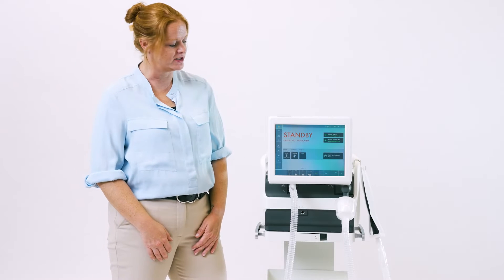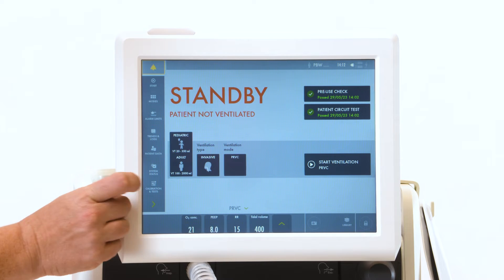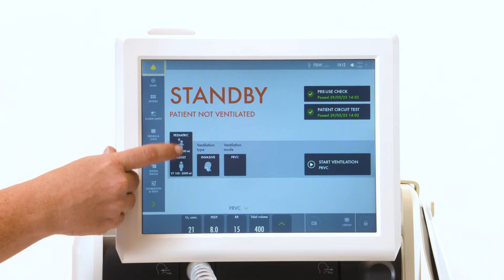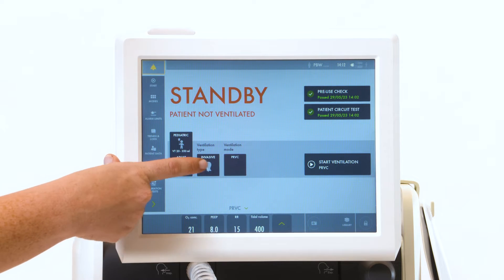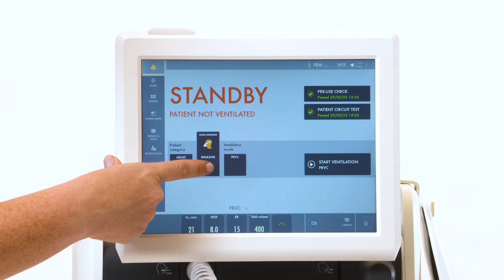Starting with the standby screen, select your patient type, whether they're pediatric or adult, followed by the ventilation type, non-invasive or invasive.